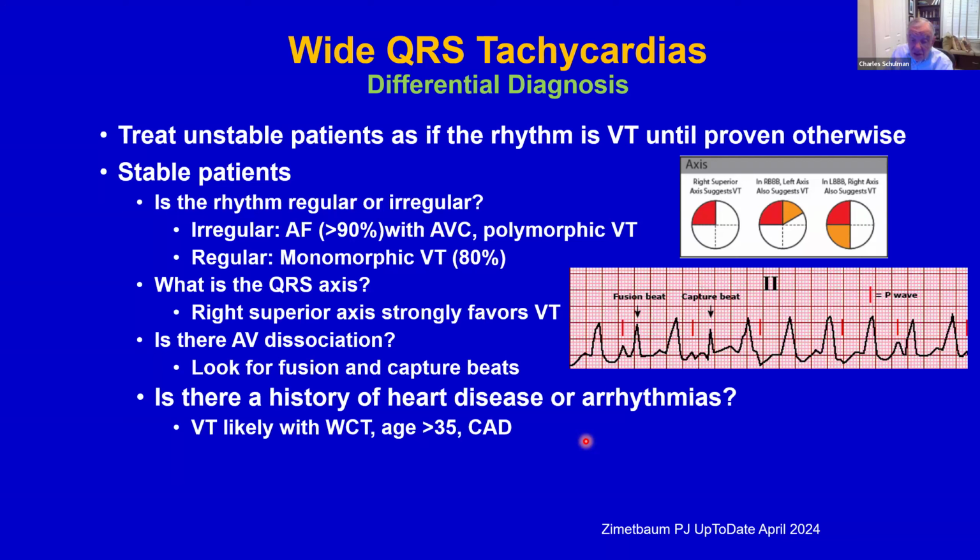Okay, now this shows fusion beats and capture beats.